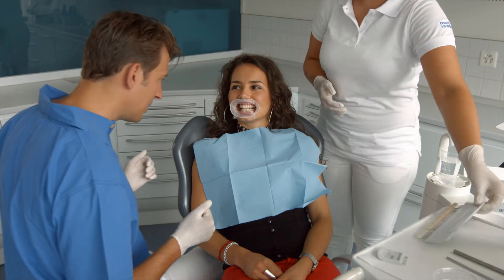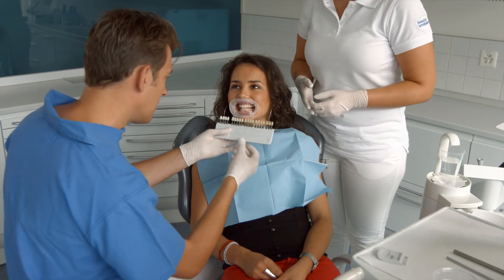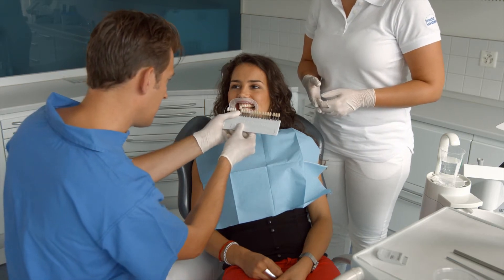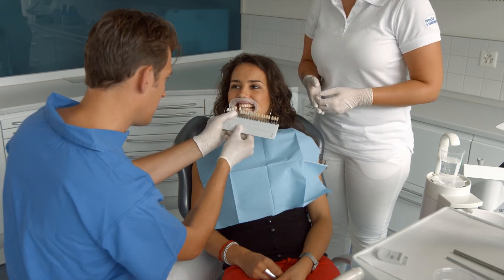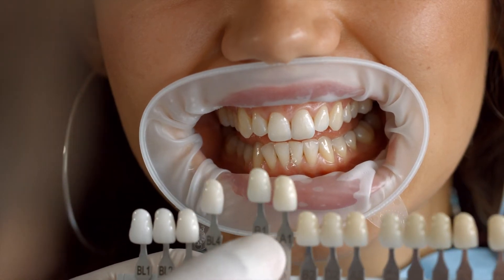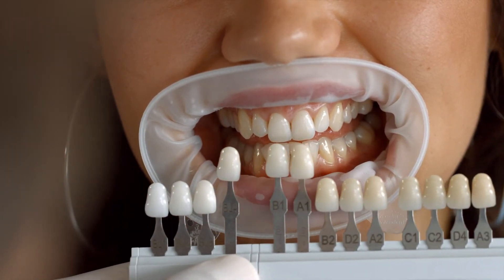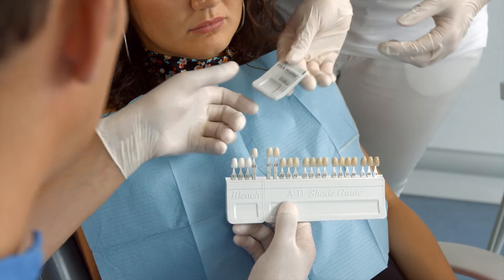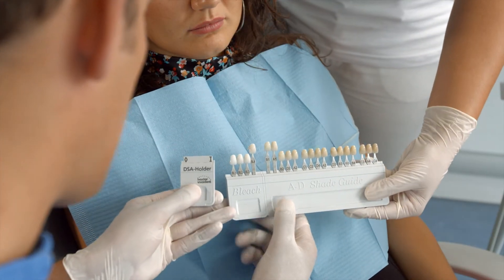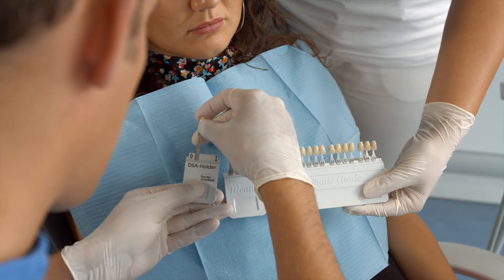Now select the three shade guide teeth that are closest to the patient's teeth. The Digital Shade Assistant, or the DSA for short, is suitable for both the upper and lower jaw. The DSA is compatible with various shade guides from Ivoclar Vivadent. Please consult the operating instructions for further information.